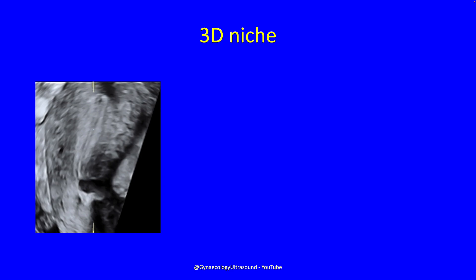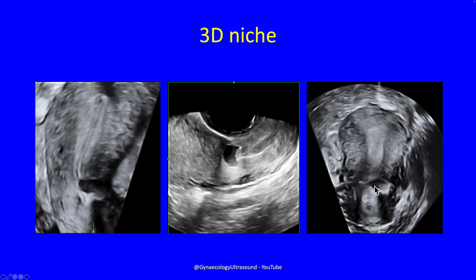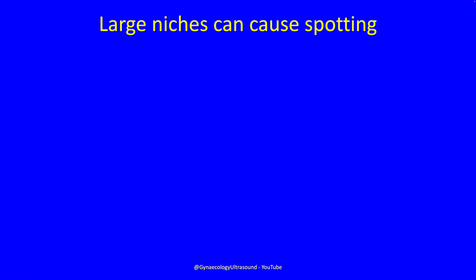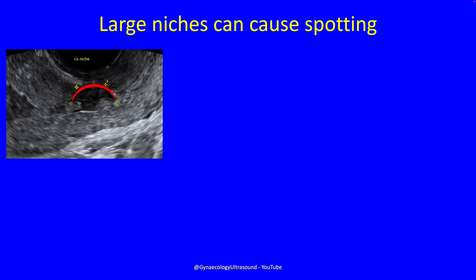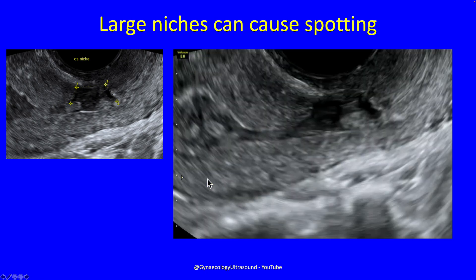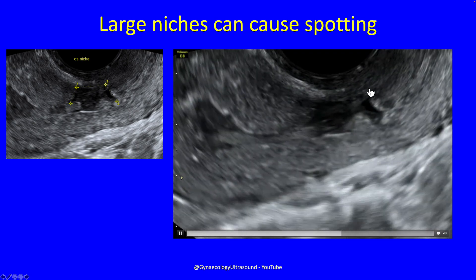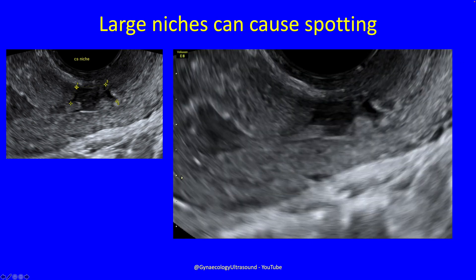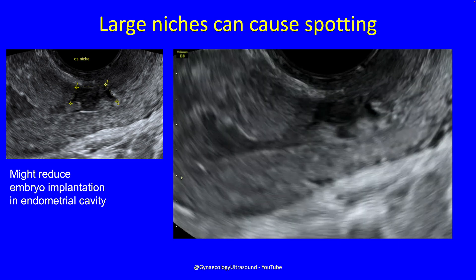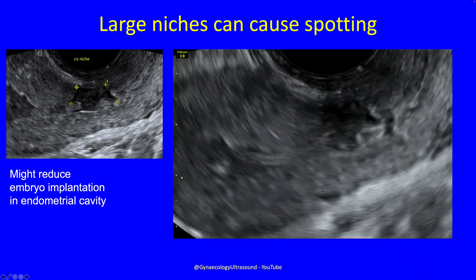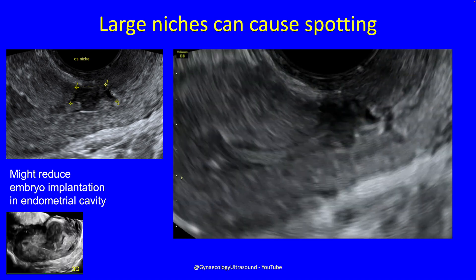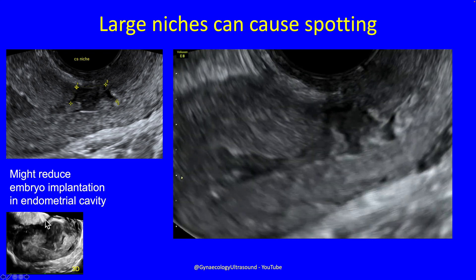You can do 3D on a niche as well — it's not super helpful, but you can see the niche in the longitudinal and transverse planes. The transverse plane is quite useful for showing the extent of the niche laterally. Large niches can cause spotting because in this niche it's almost impossible to see any myometrium overlying it, and you can see menstrual fluid and clot literally sloshing in and out. The fluid can collect and then trickle out over the next few days after the period has finished, and you can imagine how this fluid might reduce embryo implantation in the endometrial cavity. There's a 3D image showing this tremendous bulging anteriorly.